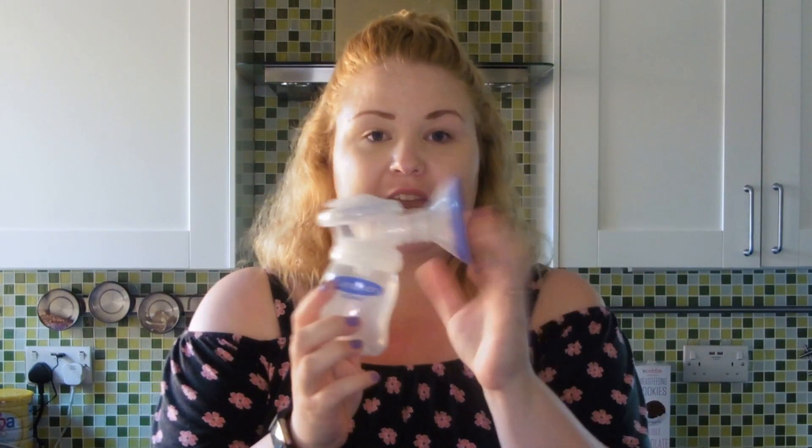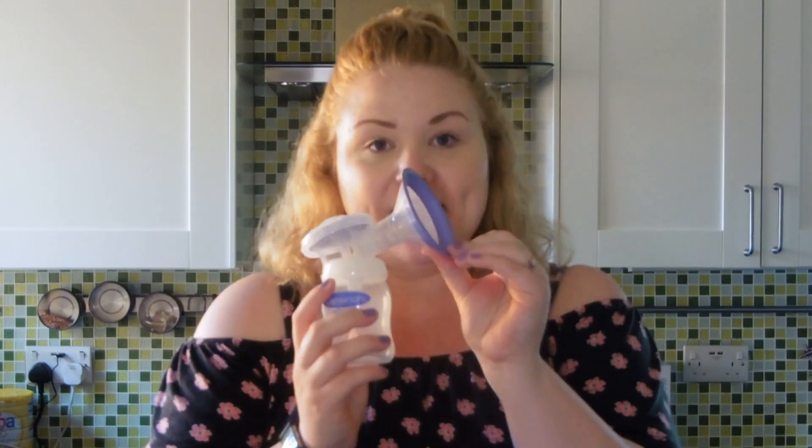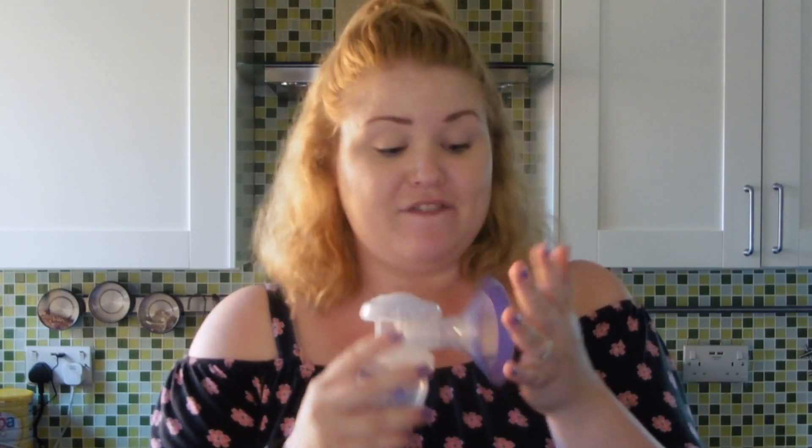To go along with the pump you get the bottle and — its official name — it's actually a comfort fit breast cushion. This is the part that obviously suckers on to your boob. I can confirm it is very soft and it is very comfy, no problems with it. It's a bit flexible around the edges which really helps it to sucker on.